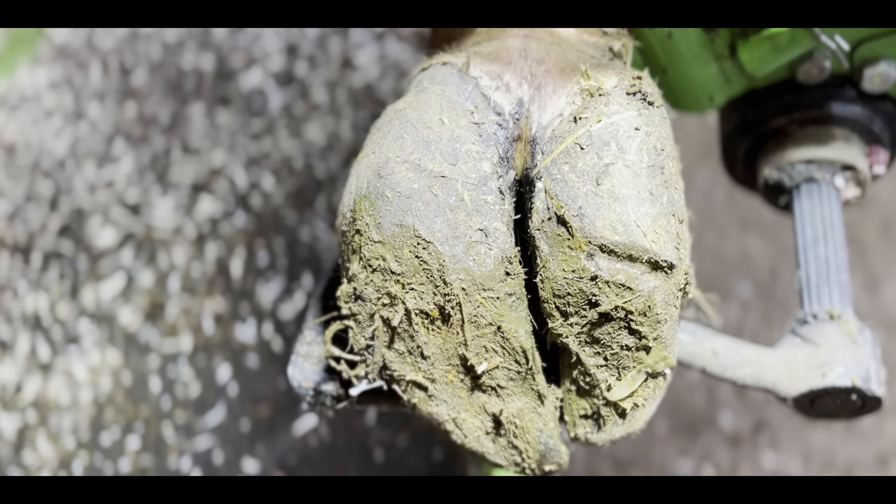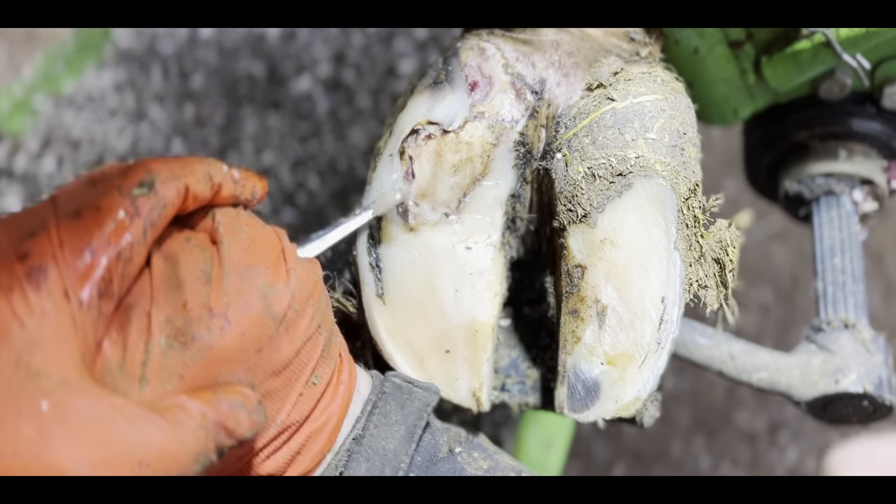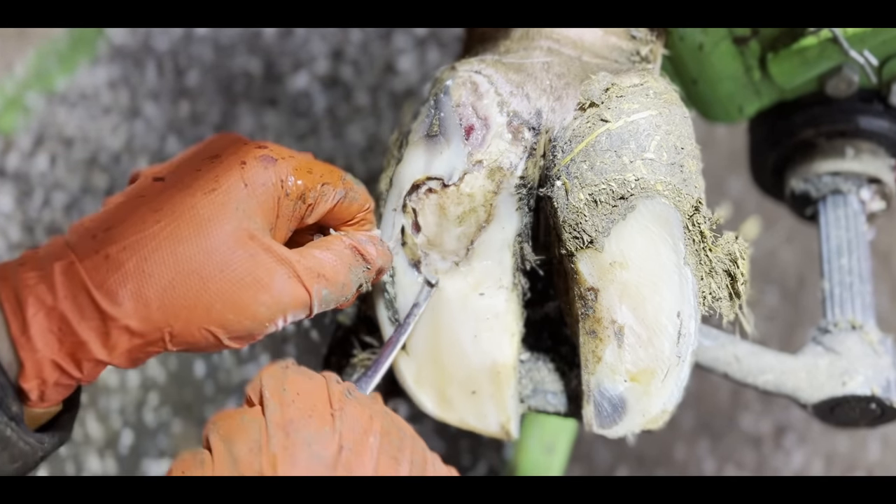Can you spot the massive crack in this cow's hoof? No? I bet you can now. This is the Hoof GP.